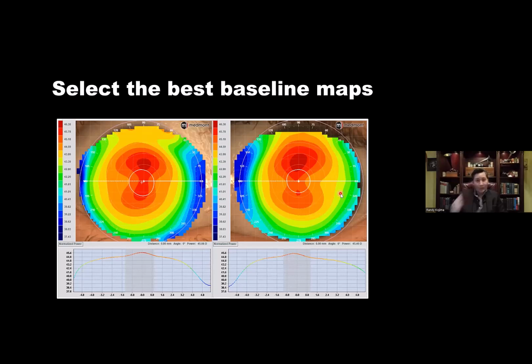If the patient is struggling with that initial topography capture, and they're just intimidated by the instrument getting close to them, or all these new procedures, a new office, a new doctor, all of these things, if you have to, bring them back a second day. I've found with some kids, I've gotten much better topography just because they were more used to the instrument at that point.